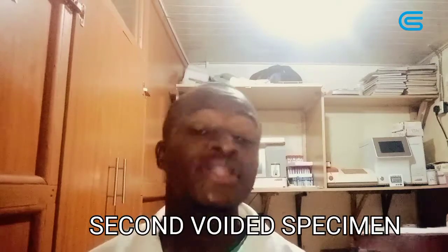So we have the third type of specimen called the second voided specimen. In this case, the first morning specimen is discarded and the second specimen is collected and tested. So the first morning specimen, you discard it, then we go for the second specimen, which we collect and we test. Such type of specimen is majorly good for reflection of blood glucose and keeping of formed elements intact.